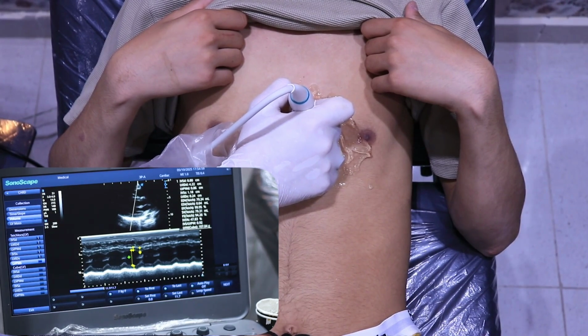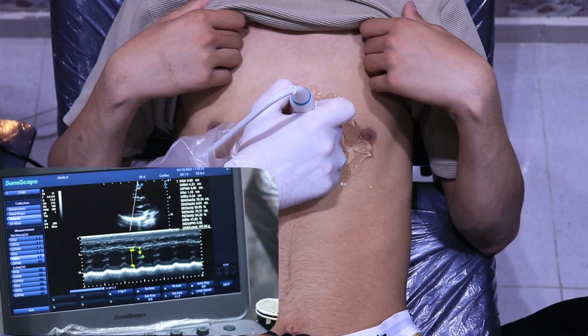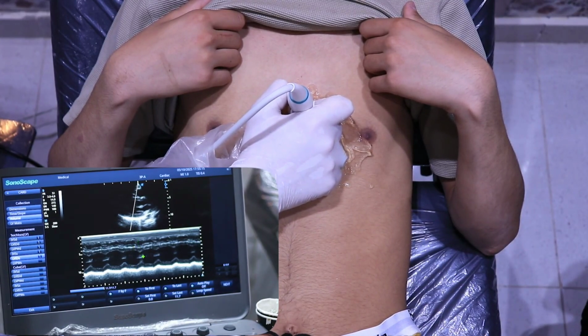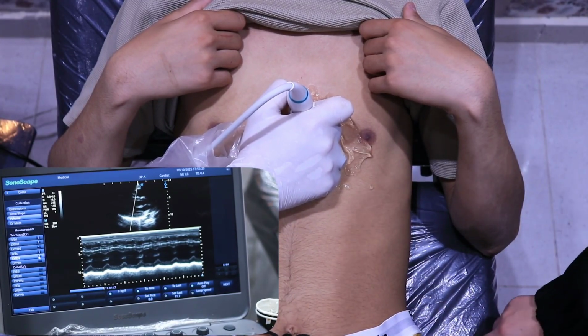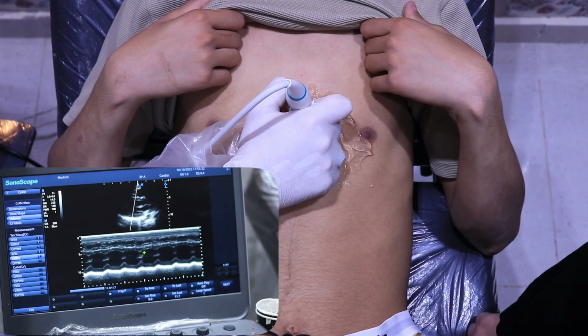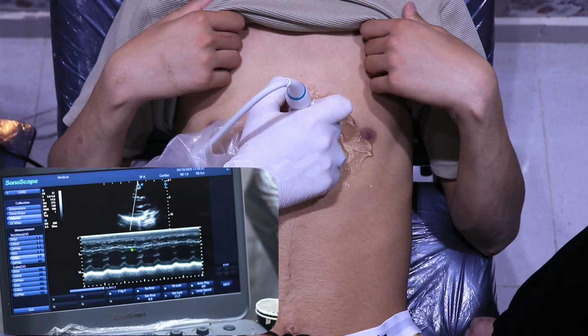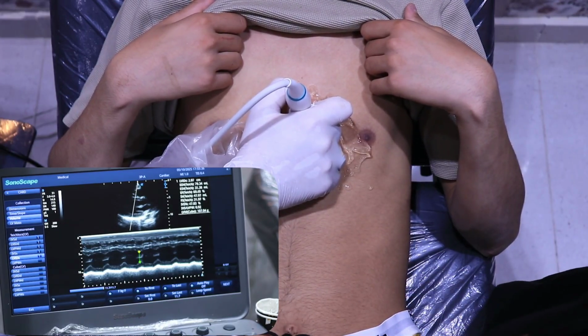احنا عايزين delete يا مستر حمدي. ال internal dimension ده غلط. So if you have a measurement which is wrong, we need to delete this measurement, right? Clear? Okay. So clear this. Alright. So we'll take the internal dimension during systole. Okay, so from here till here.